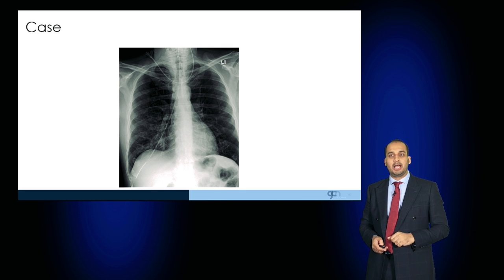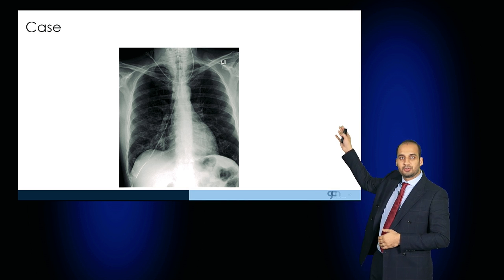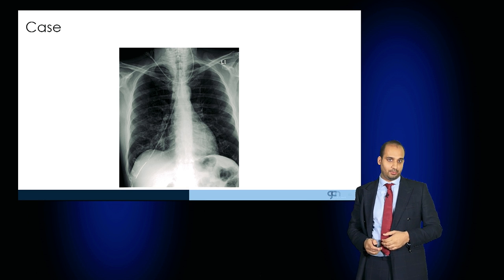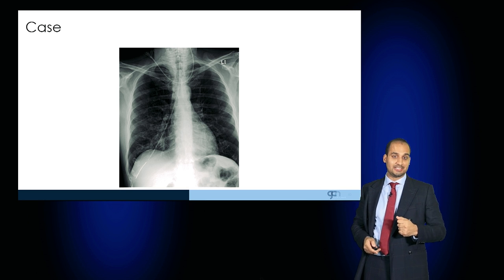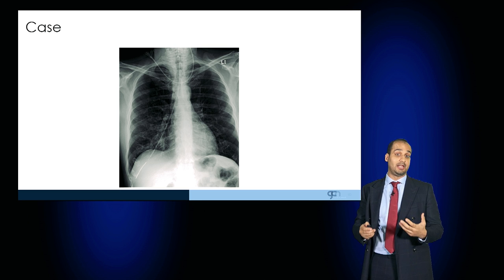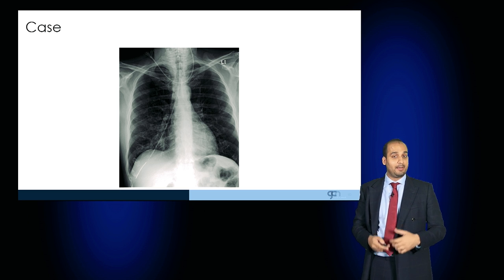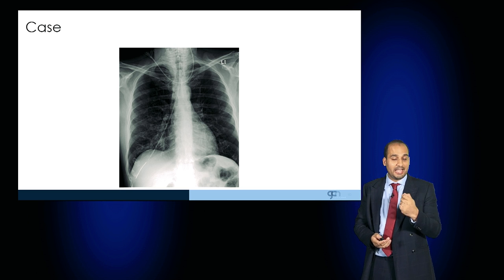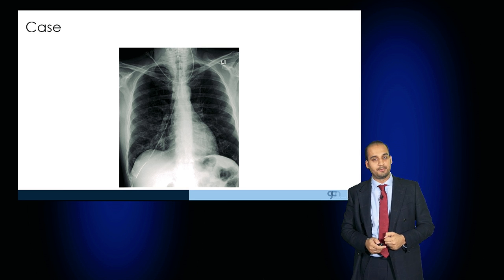Here is an incorrect NG tube placement — you can see that the NG tube tracks straight into the right main bronchus. That should not be used and should be removed immediately. Most likely it would be causing the patient a lot of discomfort and coughing. But you might have a sedated patient where you can't detect those clinical signs, and that's why the radiograph is very important.